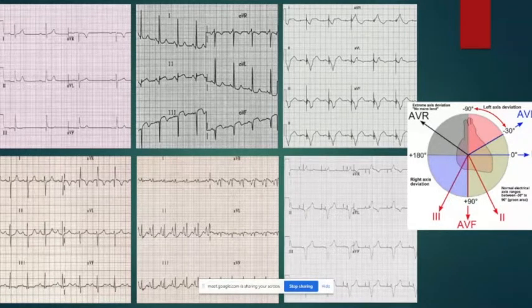Sometimes in young people, in sinus rhythm, you have sinus arrhythmia, and the RR interval is not the same every time, but then you can average as well. But usually, when the patient is in sinus rhythm and the RR interval seems constant, then you don't need to average. Thank you. Have I answered?